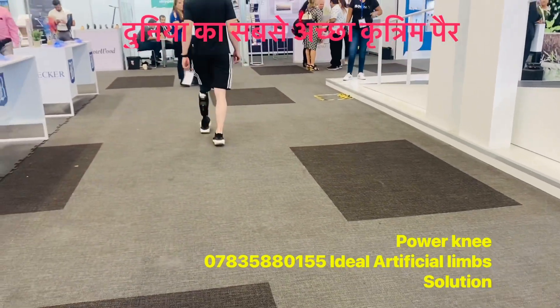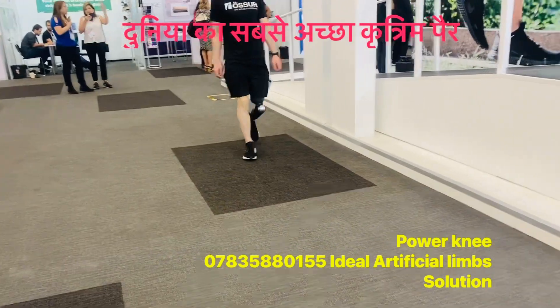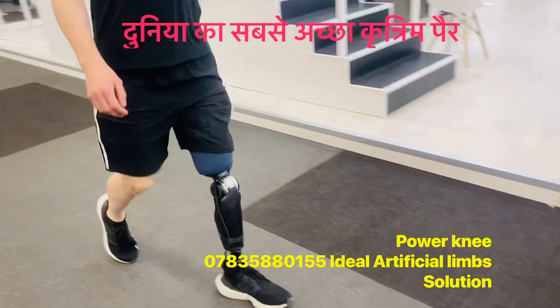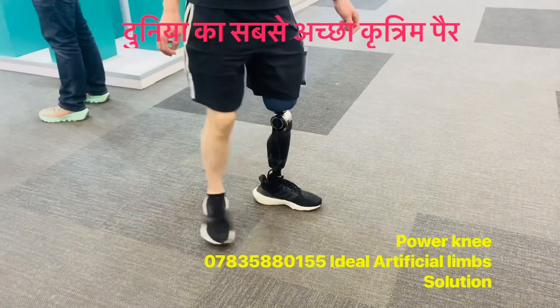Yes, the motion of degree. For the velocity that the patient is walking — if he is walking faster, he needs a higher degree. If he is walking slower, then it needs a lower degree.